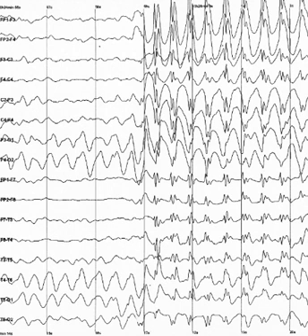Action potentials are very fast and, as a consequence, the chances of field summation are slim. However, neural backpropagation, as a typically longer dendritic current dipole, can be picked up by EEG electrodes and is a reliable indication of the occurrence of neural output. Not only do EEGs capture dendritic currents almost exclusively as opposed to axonal currents, they also show a preference for activity on populations of parallel dendrites and transmitting current in the same direction at the same time.